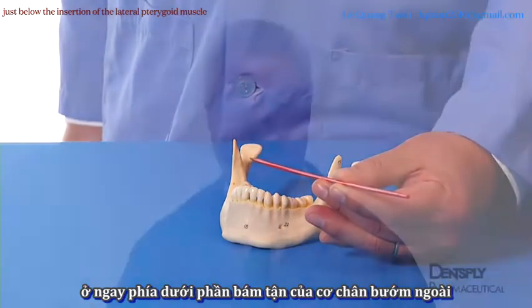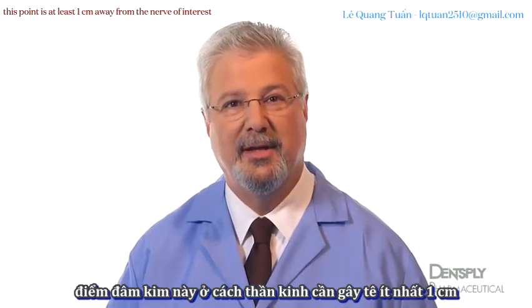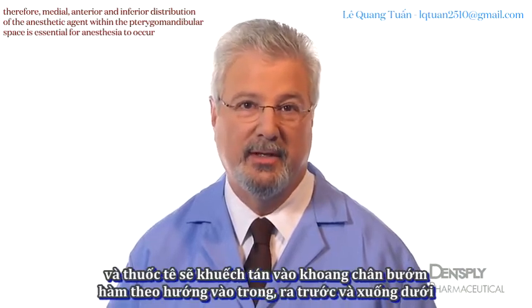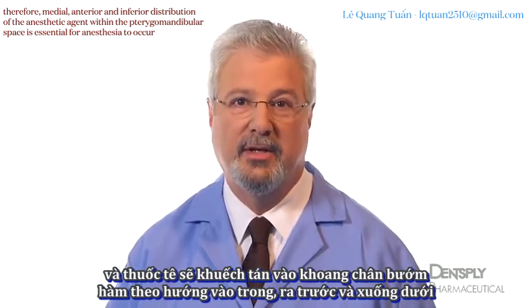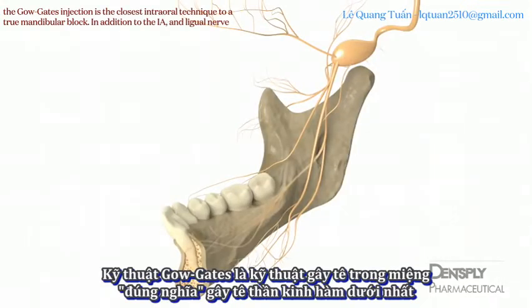The target for the Gowgates injection is the neck of the condyle, just below the insertion of the lateral pterygoid muscle. In contrast to other intraoral nerve block techniques, this point is at least 1 centimeter away from the nerves of interest. Therefore, medial, anterior, and inferior distribution of the anesthetic agent within the pterygomandibular space is essential for anesthesia to occur. The Gowgates injection is the closest intraoral technique to a true mandibular block.